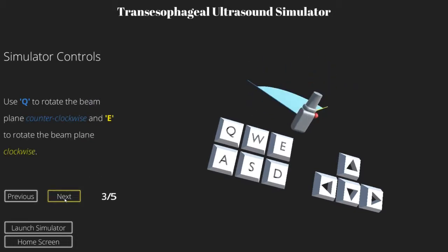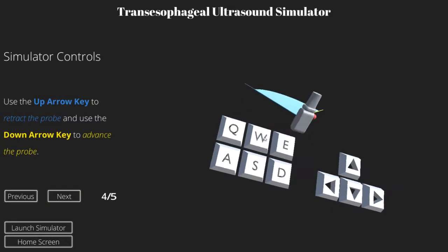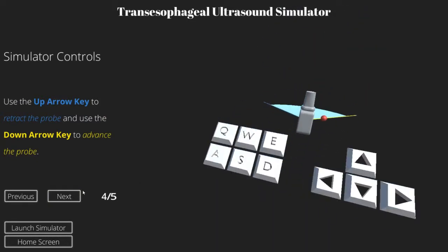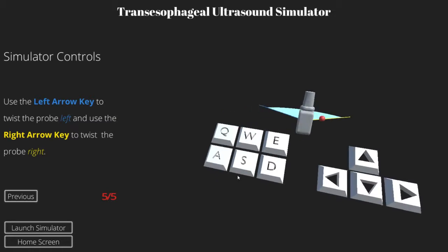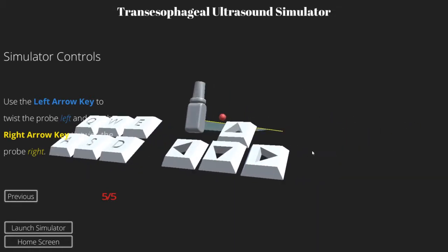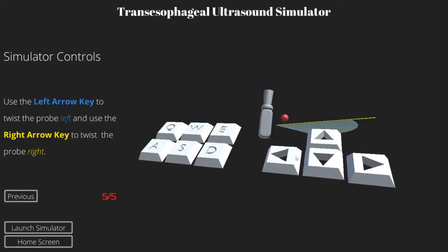Q and E to rotate that beam. Up arrow and down arrow to retreat and advance that probe. And left arrow and right arrow to actually simulate what it's like to twist the probe while you're doing an exam. The buttons react dynamically, or the animation reacts dynamically. So we'll launch this simulator.